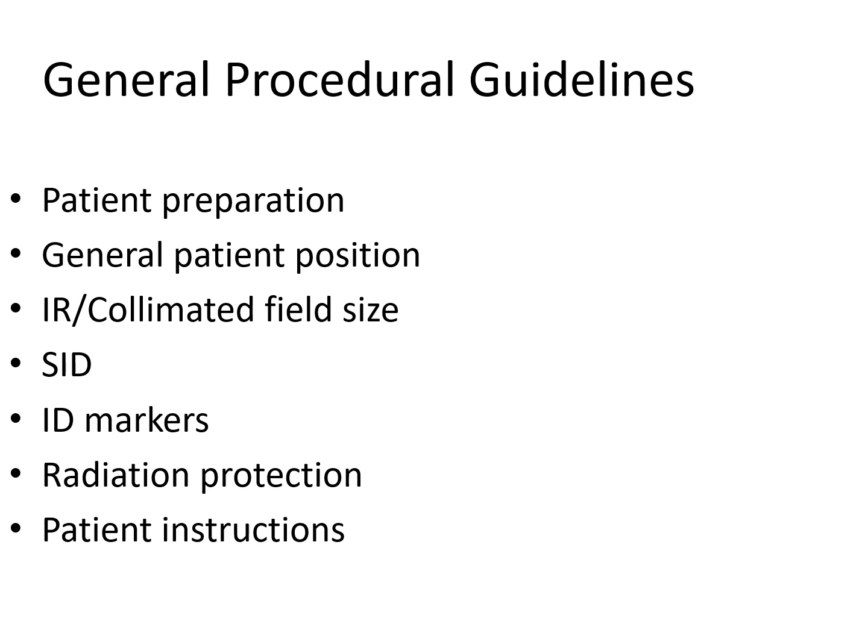Patient position, most commonly, is upright, but supine is warranted in case of trauma or in case of sometimes the geriatric folks sway a little bit side to side, and so you're introducing motion artifact. If you try to stand them up for a cervical spine, you might find it's just easier to lay them down for cervical spine x-ray. That being said, you should always try to attempt the lateral cervical spine x-ray vertically. It just presents better, and it's a better x-ray if you make an attempt to do that one while the patient is standing up.